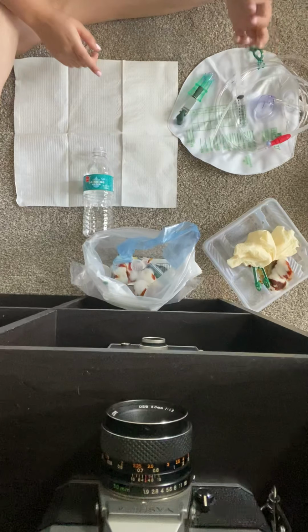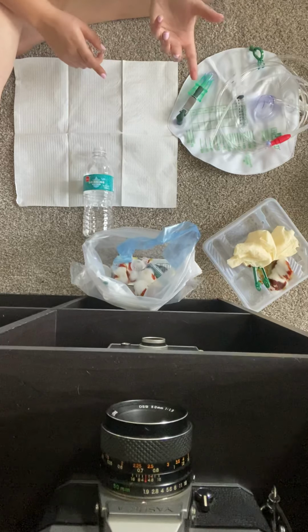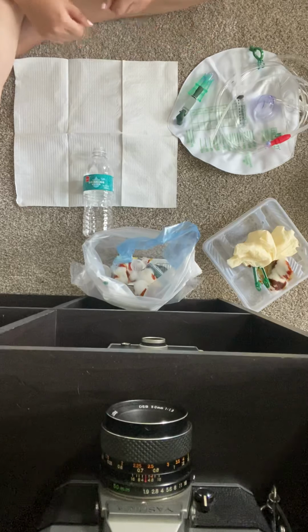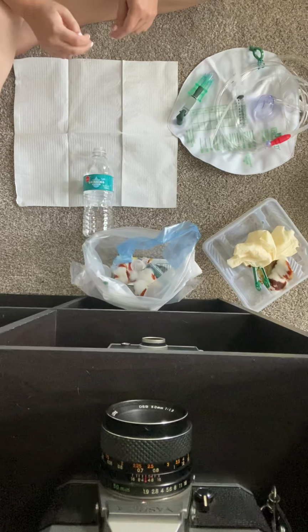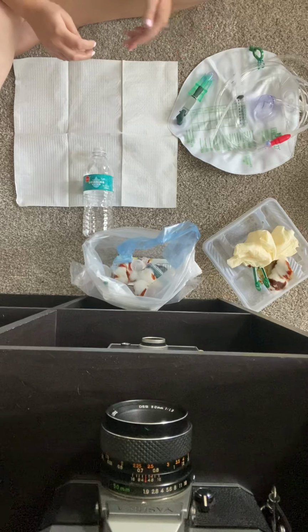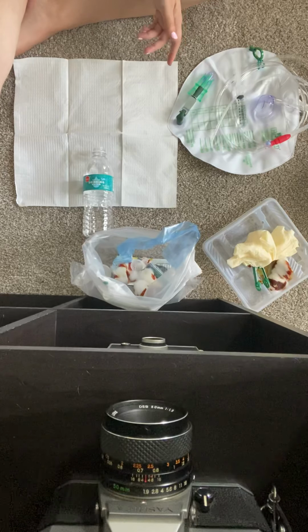So 10 cc's, and then what's the actual capacity? I think it's normally 10. Well, yeah, I think it's 10. And then when they did have output, if there was an odor or anything like that, you would want to note that.